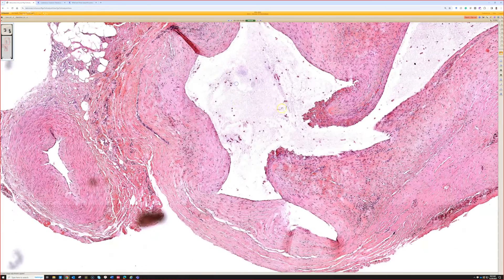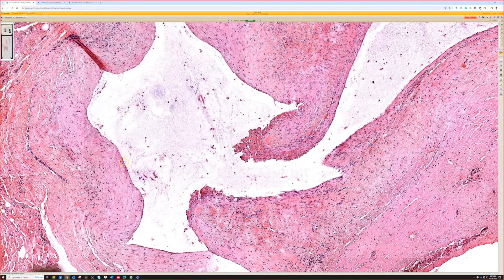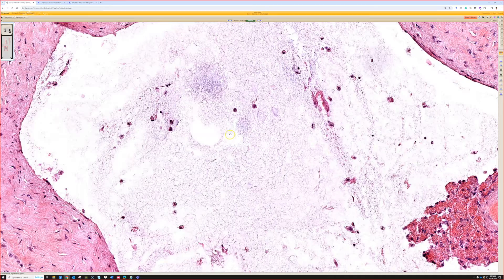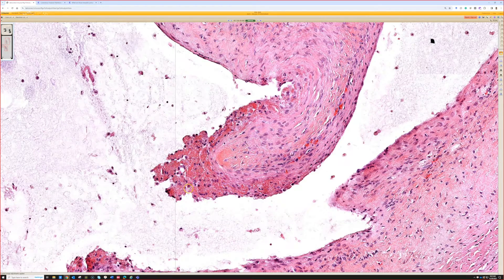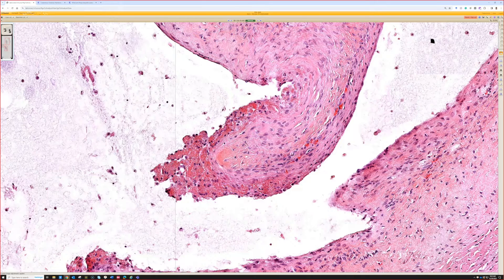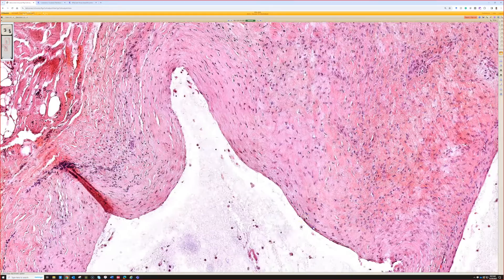When you're lucky, you'll get the whole specimen with the myxoid material inside. You may get scattered histiocytes acting as mucophages eating up the synovial fluid, sometimes fibrin, and sometimes abundant fibrin deposition, hemosiderin, blood, and hemorrhage. When there's trauma, people sometimes try to crush their ganglion cyst with a large book - historically called 'bible cysts' because people used the biggest book in the house. I am not advocating for that; while it can sometimes make the cyst rupture, it may refill and can cause local tissue trauma.